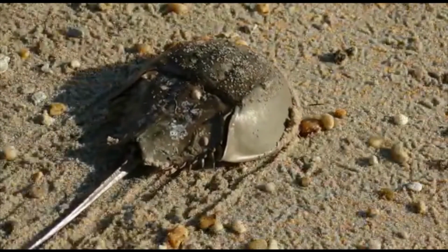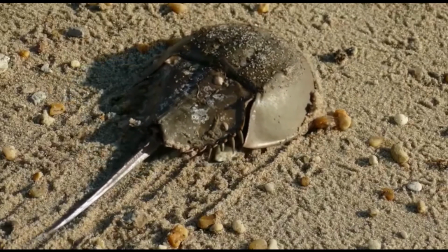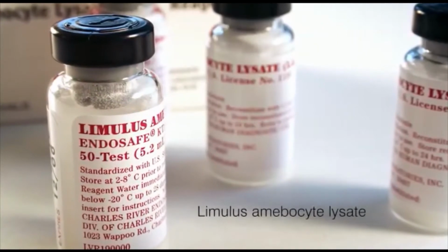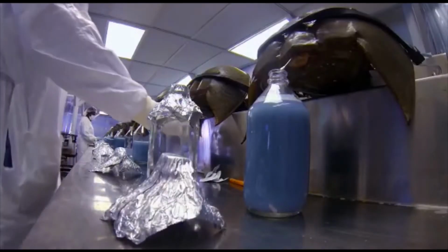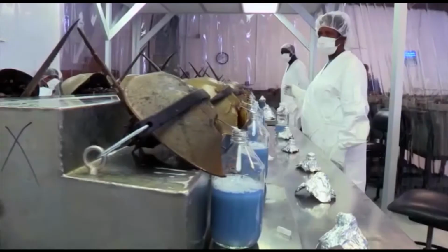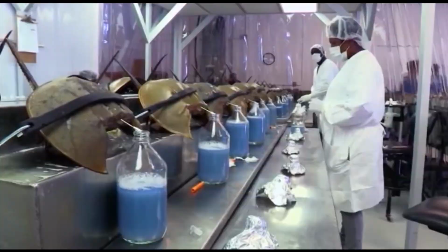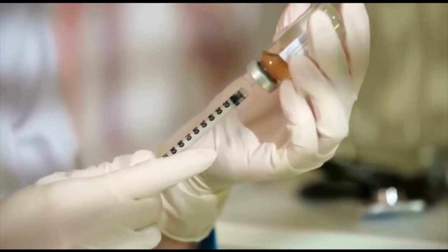The Atlantic horseshoe crab, Limulus polyphemus, has long been valued by the biopharmaceutical industry as a source of critical proteins that detect the presence of harmful bacterial endotoxin. Called Limulus amoebocyte lysate, LAL, these proteins come from the animal's blood cells, amoebocytes, and serve as the foundation of the LAL endotoxin test. In the 50 years since its discovery, LAL has proven to be the most sensitive and effective indicator of endotoxin contamination in treatments like vaccines, IV drugs, and medical devices.